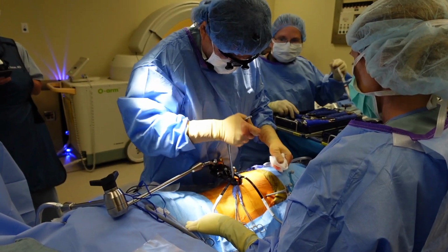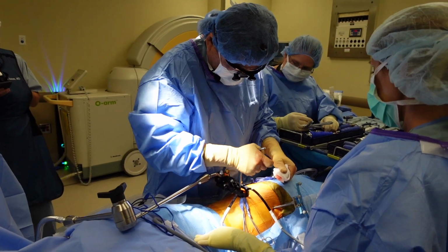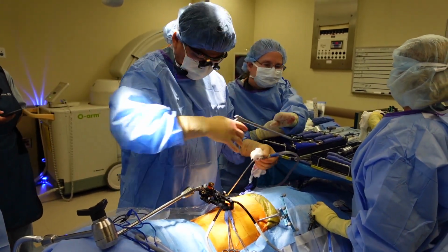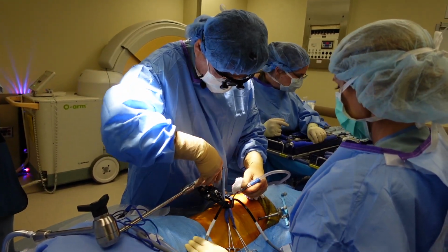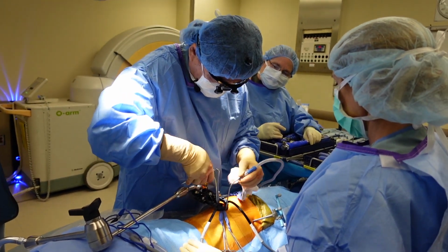Light on. I've got the retractor down. I'm looking at the disc. I'm doing the discectomy. It's a beautiful view. I have exposed exactly what I need. No more, no less. That's one of the tenets of minimally invasive surgery. Don't make a big incision for a small surgical target site. Try to make your surgical corridor as much in line with the target site as possible.